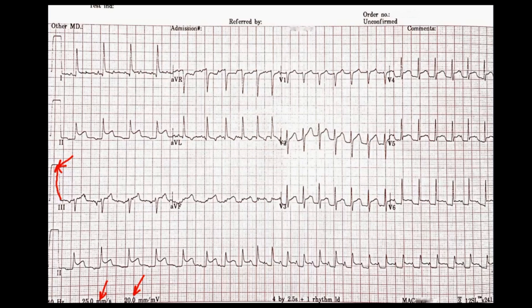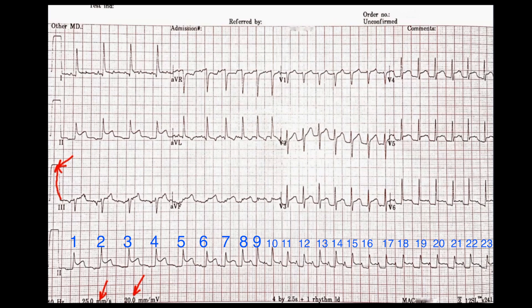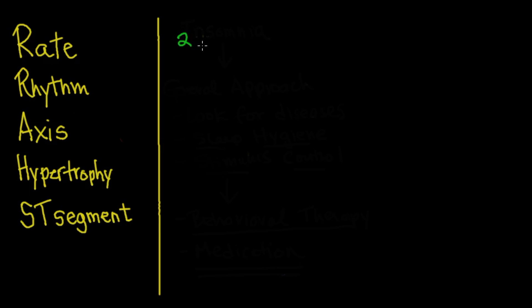Just by looking at this EKG you can tell right off the bat that the spaces between the QRS complexes at the beginning are different than at the end, so there may be a rhythm change. This is a 10-second strip, so because there are six 10-second periods in a minute, we can count 23 QRS complexes and multiply by 6, giving us close to 138 beats per minute — that's the average for the whole EKG.